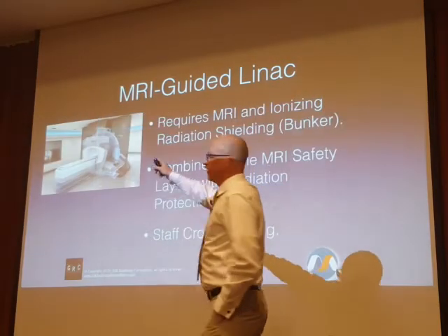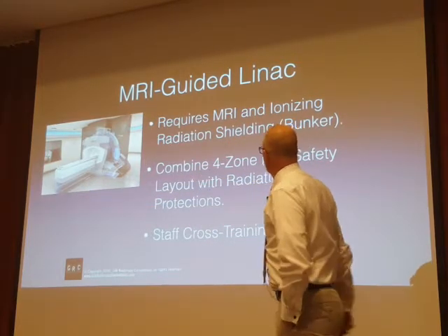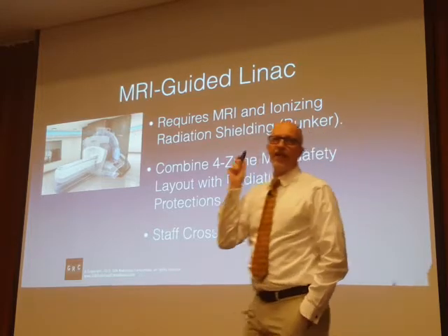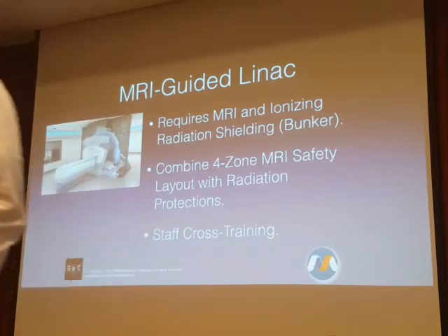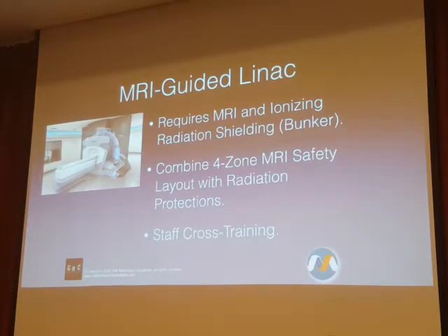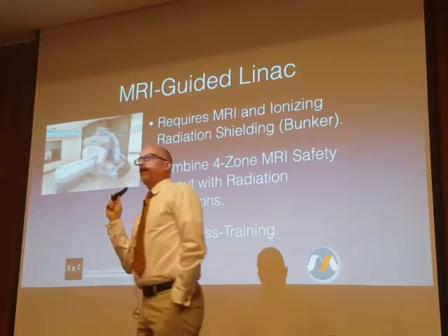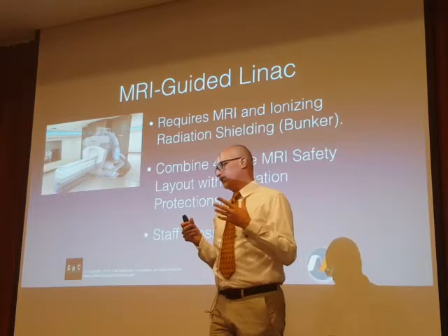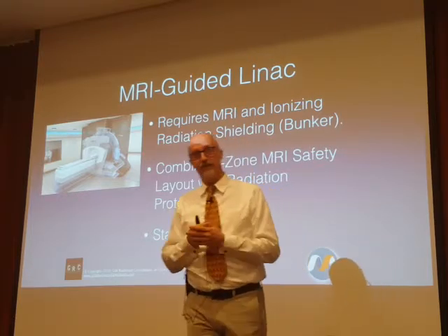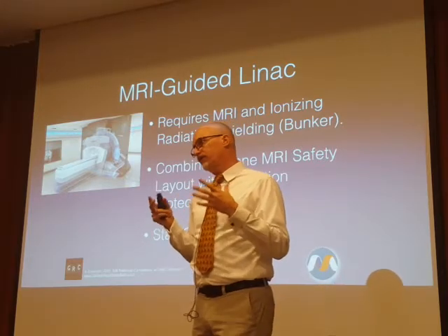This is one of the manufacturers. There are 3 or 4 different manufacturers now that have different types of systems. Like the PET MR, it requires a marriage of radiation shielding and conventional MRI radiofrequency shielding. Those can be difficult to coordinate together. With the linear accelerator, the bunker construction itself is very unusual from an MRI perspective. So the radiation protection piece there is unusual.